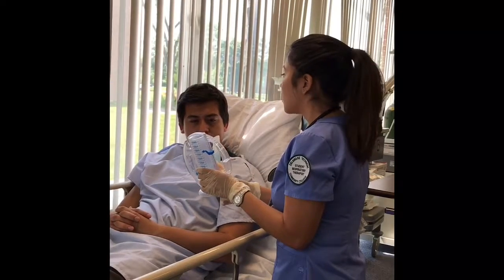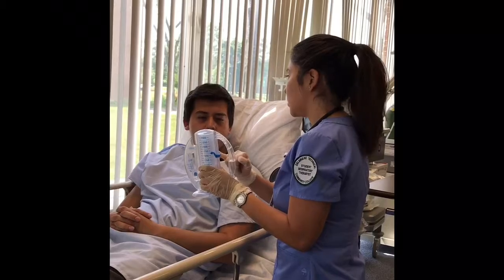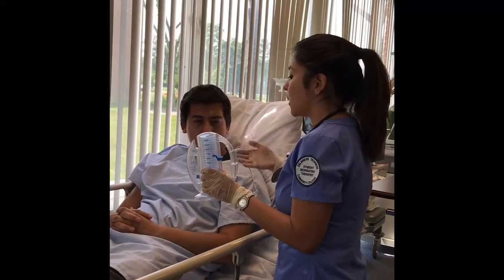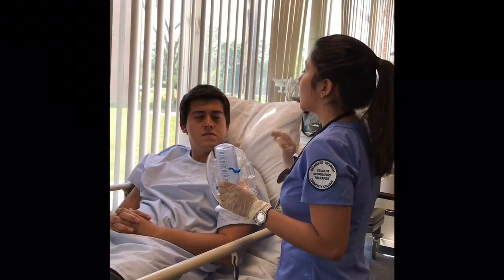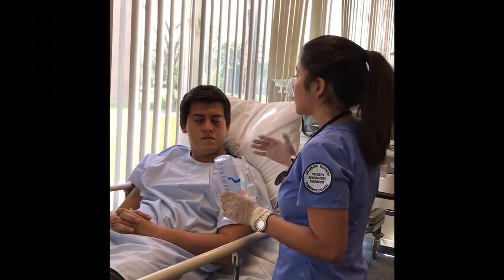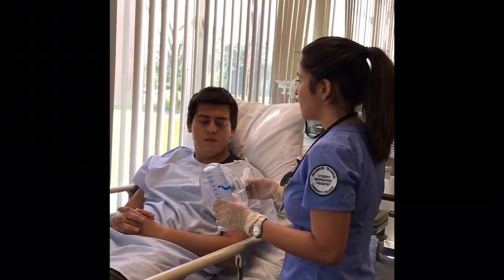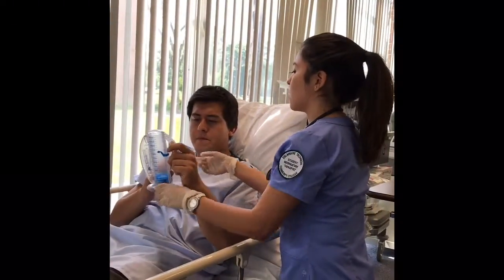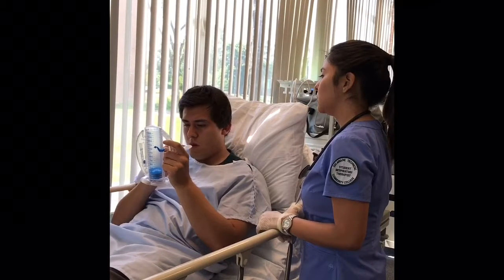Now we have a goal that we want you to reach today. It's gonna be right here as indicated with this blue little indicator. You're gonna breathe in until you reach it. After you breathe in, you're gonna hold that for just 5 seconds. So count to 5 in your head, okay? Then you'll exhale. Sounds good? Yeah. All right, go ahead. So create the tight seal.